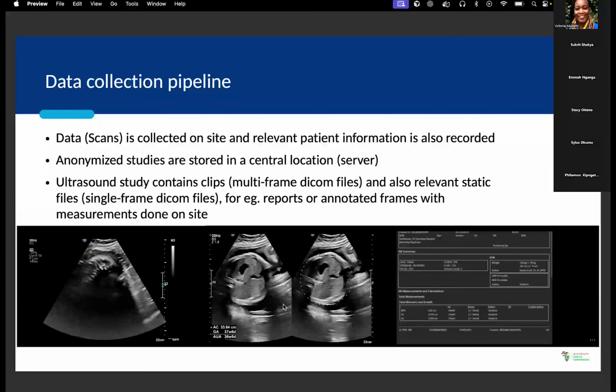And also, there's a small detail here which I'd like to explain. You might see that the top half of this image is cut off. This was done because we might also have some critical patient information, or personal information, sorry, that is embedded in the pixel data itself. So anonymizing the metadata does not clear that away.